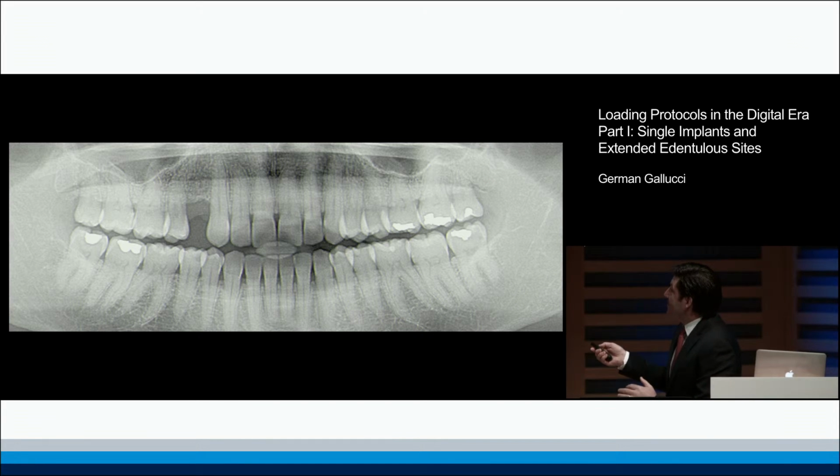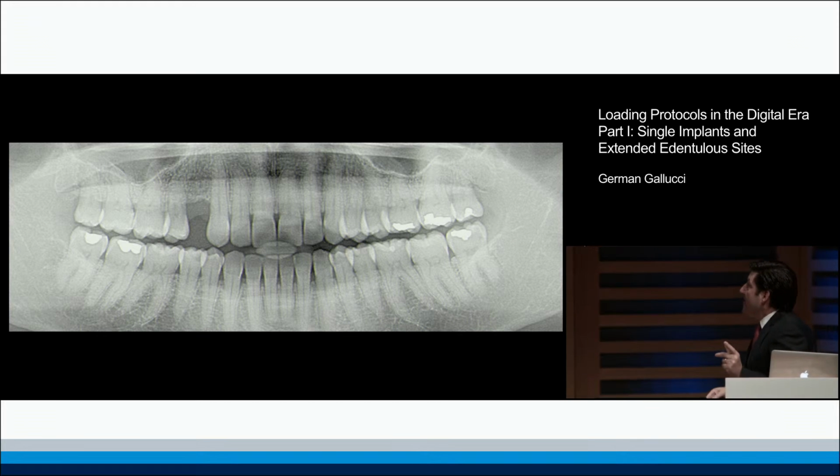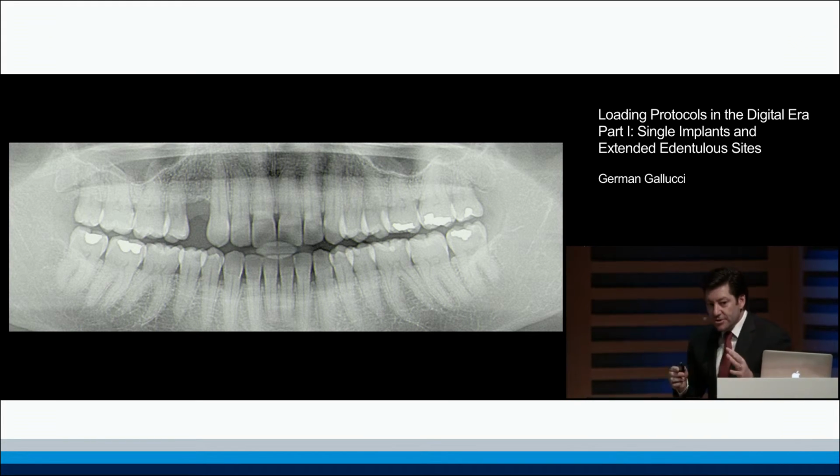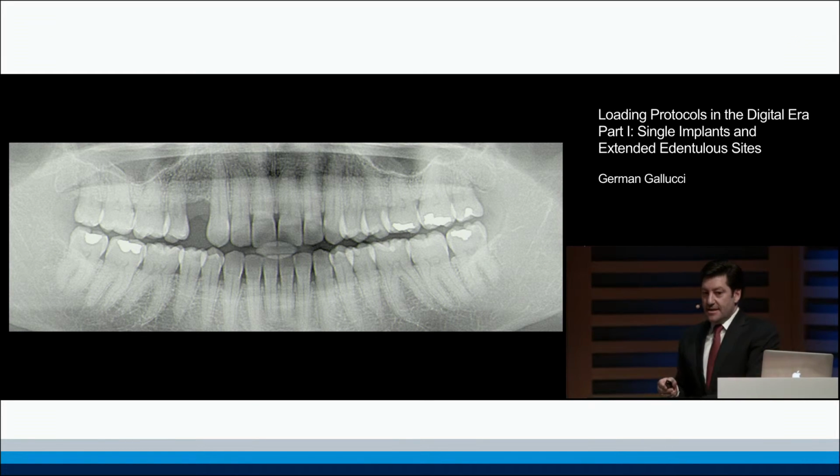If I place an implant in a healed site, the recommendation number 2, and I put a crown, it works. So that's what we did. And we were deliberating how we could do that, and I'm going to show you now a way that you can bring digital technology in a way that you can prepare that in advance for this case.